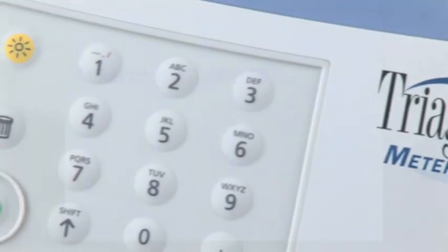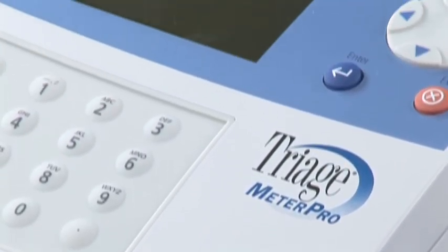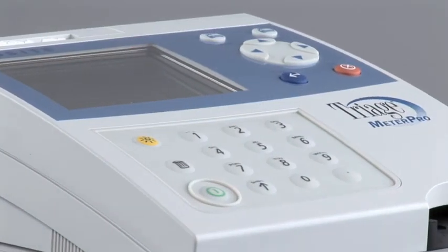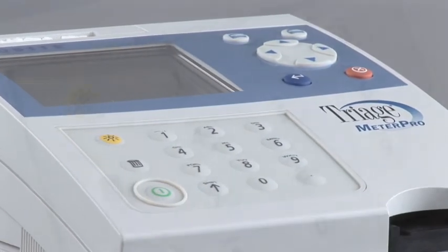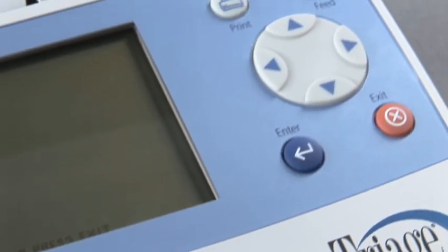Delete Results will delete all previously obtained results. The instrument otherwise automatically uses the first in, first out (FIFO) principle to store the latest results. This concludes the in-service program. Contact your local partner if you have any further questions.